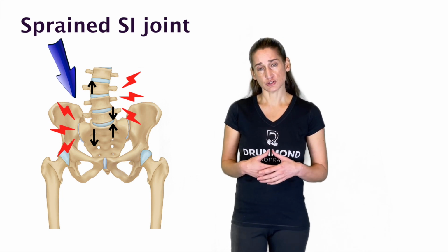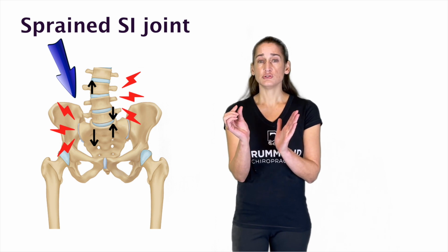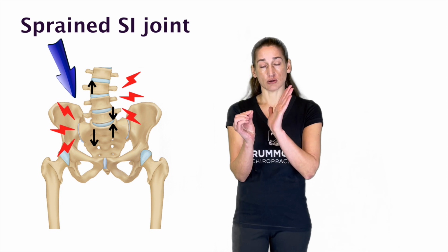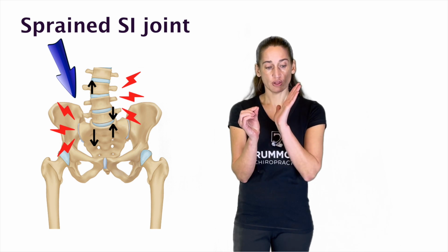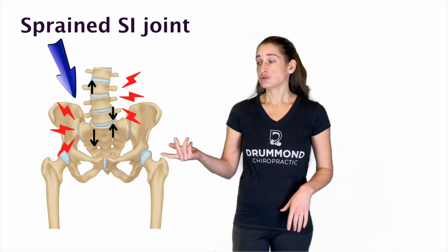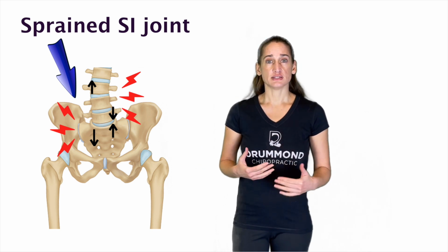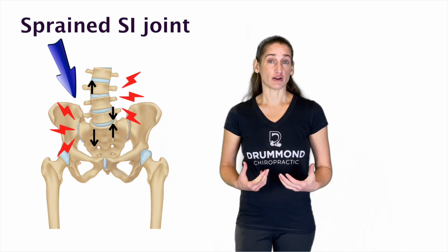to stabilize that joint. And remember, you have 2 SI joints, so as you stabilize one, you have to have follow-ups to make sure that the regular side doesn't get too tight. And that's where chiropractic care is really critical, making sure that you keep the good side well. And after wearing the SI belt for a couple months, then you just wear it during activities that might sprain the SI joint, for a month or two, depending on what your healthcare provider prescribes.